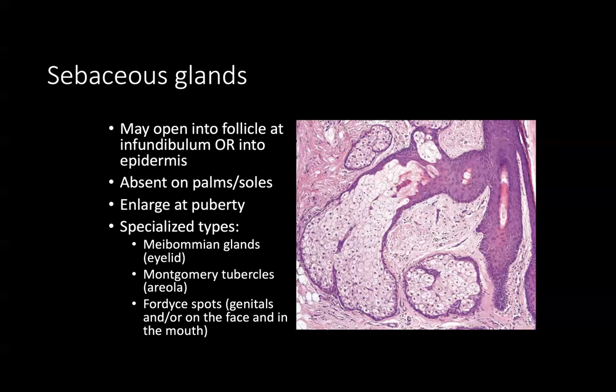Sebocytes are mostly white cytoplasm with this vacuolated appearance, and the rim of the sebaceous lobule is a very thin purple. When you start to get a really thick purple rim and you've got cells that are appearing more blue in terms of their cytoplasm, you can think about a sebaceous adenoma developing. These are larger. And you could also have something called a sebaceoma, in which it's a sebaceous proliferation, but you don't have as many of these well-differentiated sebocytes anymore. And we'll have specific lectures on sebaceous neoplasms.